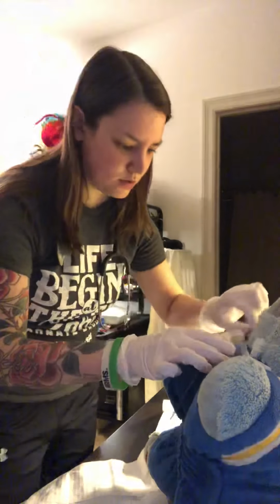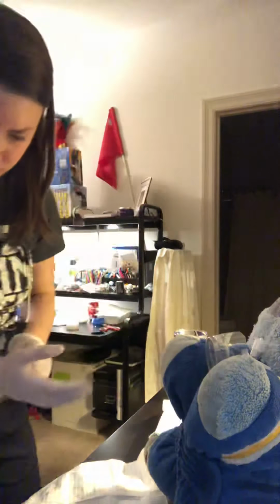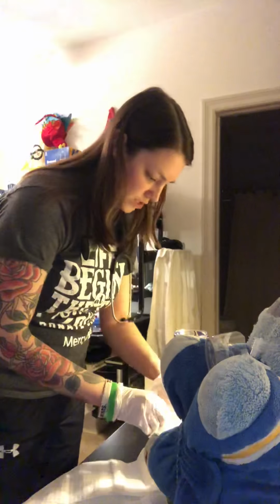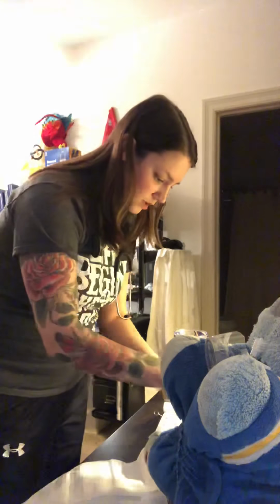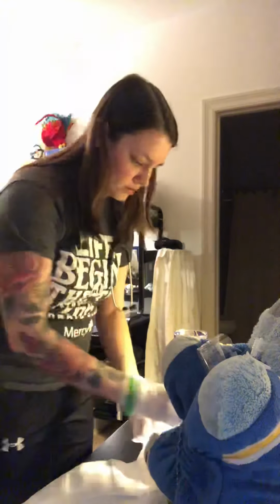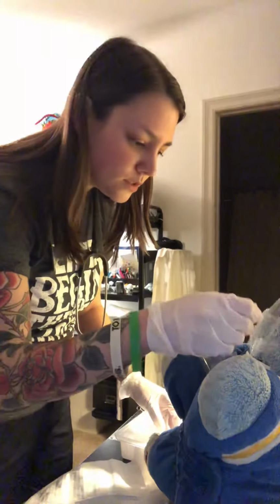Also make sure I loosen this guy here. Okay, keep it there still so I don't have to move it just yet. Then I will take gauze, not this one, and I'll make sure I get it a little wet for cleaning, and an applicator to get it all clean there. Go ahead and remove the old dressing. I don't have one in here, but I would remove the old dressing. And then I will take my sterile saline, and I get it all cleaned up in there, around.